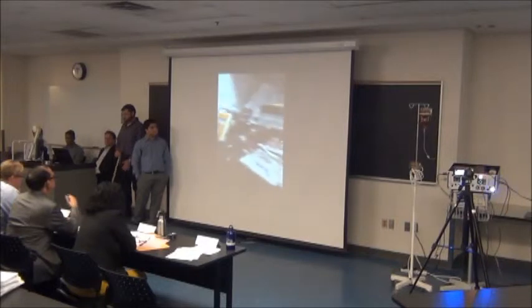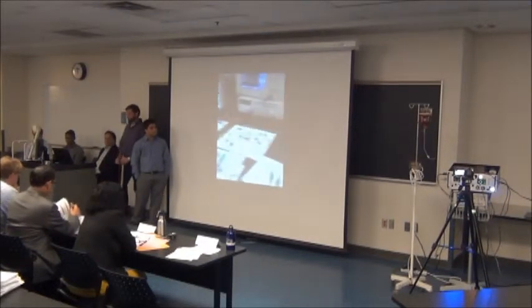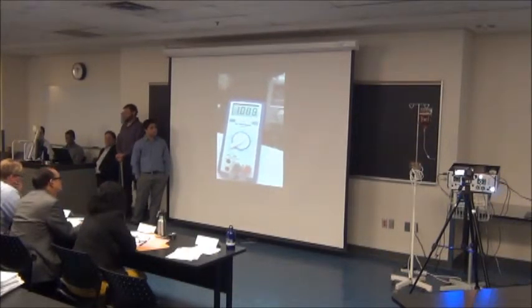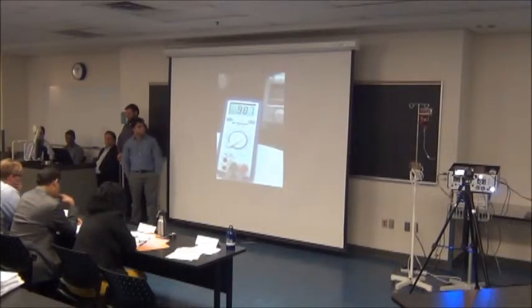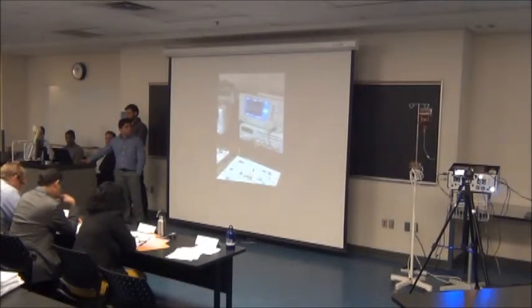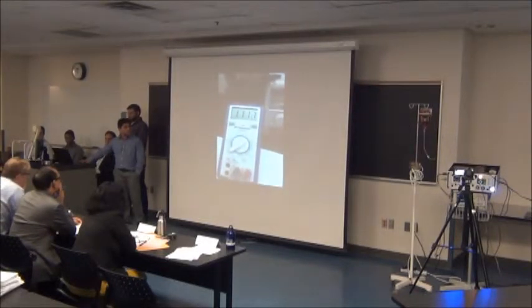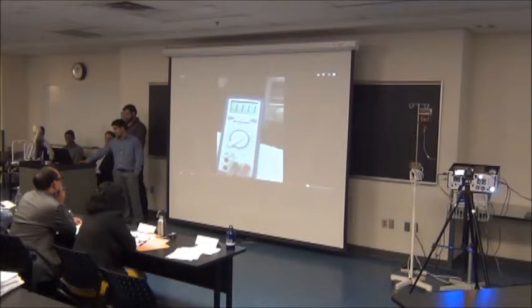Okay, yeah, we'll change the actual beats per minute to 100 beats per minute, and as you can see, it's a little bit unstable, but it's going up to almost 1 volt, which is what we want. And then we're going to 120 now. And it's increasing. Very good.